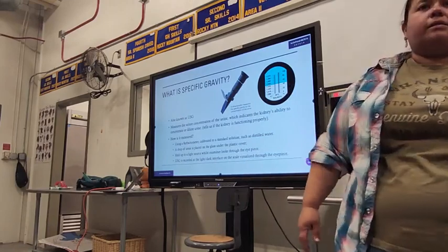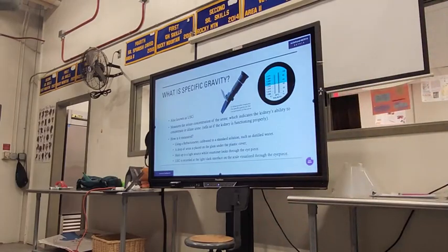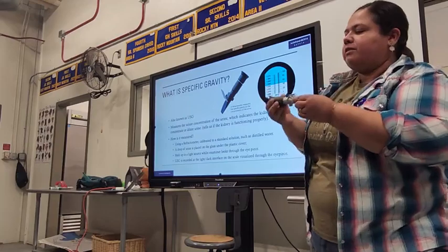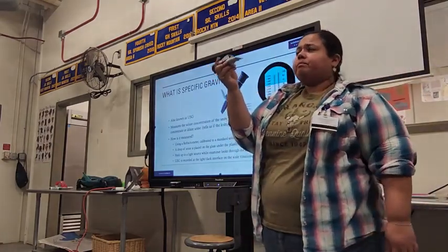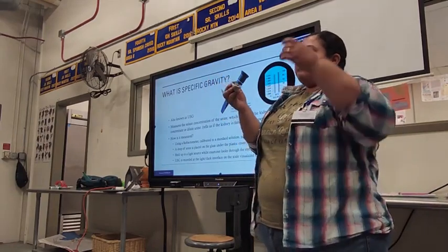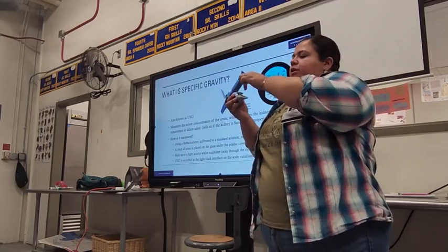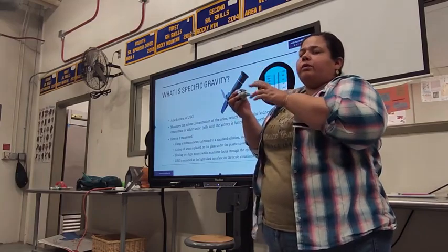Okay? Yes? Where do you put it in from? Okay. May I? I have a specific slide on how to use this, so I'm going to go over it really quick just because that question was asked. What you do is you lift up this plastic cover. You're going to take a pipette, dip it in your urine, suck up some urine. You're going to place 3 to 4 drops. You can do 2 to 3 also.